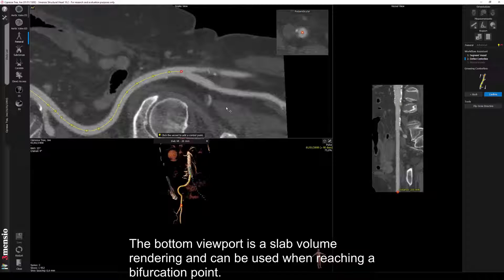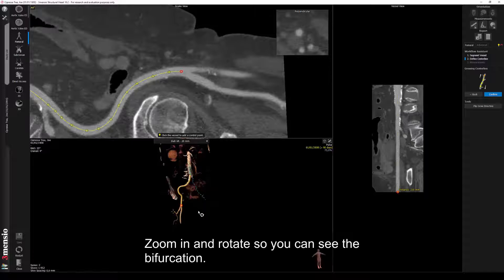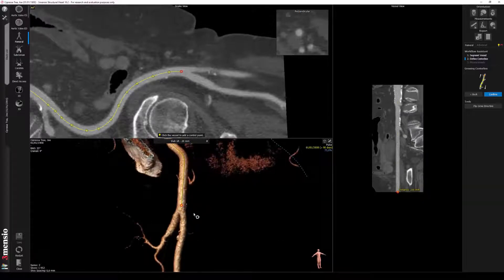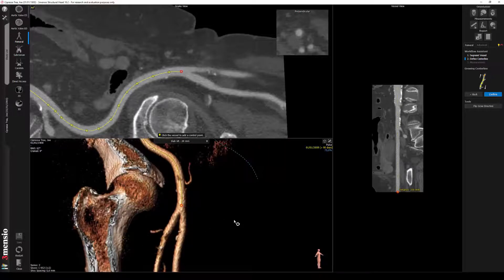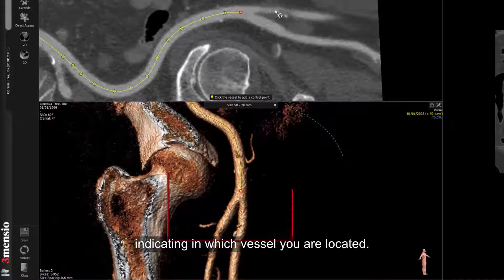The bottom viewport is a slab volume rendering and can be used when reaching a bifurcation point. Zoom in and rotate so you can see the bifurcation. When you move your mouse in the snake view, you see a yellow plus in the volume rendering indicating which vessel you are located in.